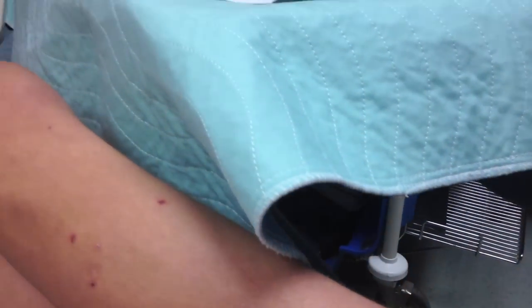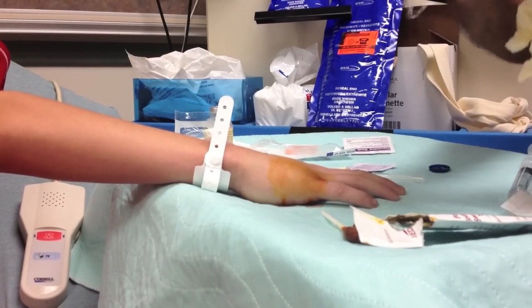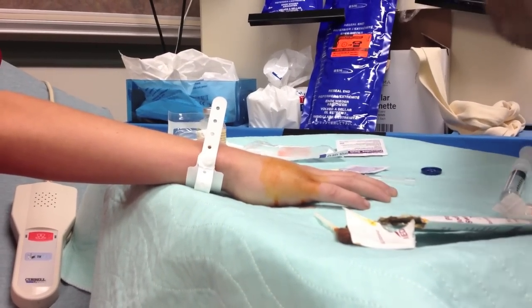Alright, so we have a boxer's fracture with a 45 degree angulation.